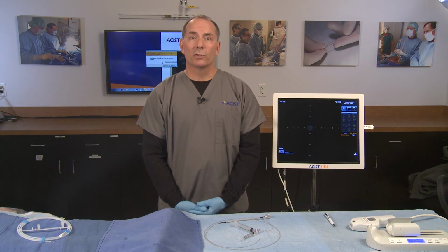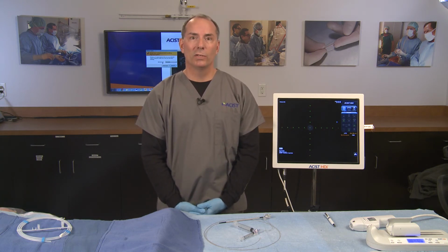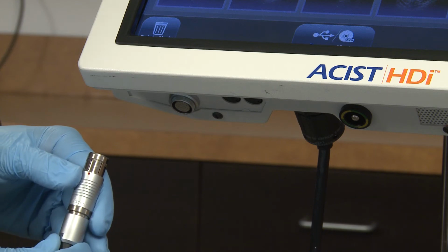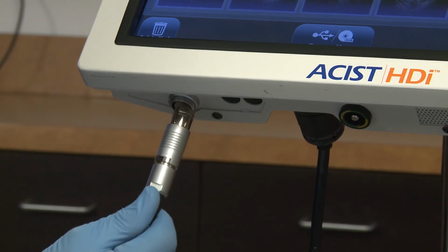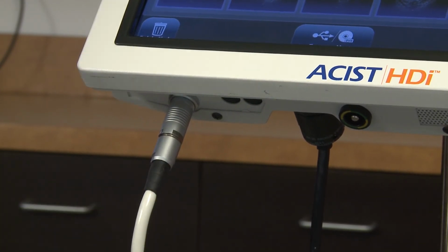The setup procedure involves connecting the PIM and optional LTS to the system console. To connect the PIM to the console, align the red dot on the PIM connector to the red dot on the PIM receptacle on the underside of the console. Carefully insert the PIM connector until it is securely seated.